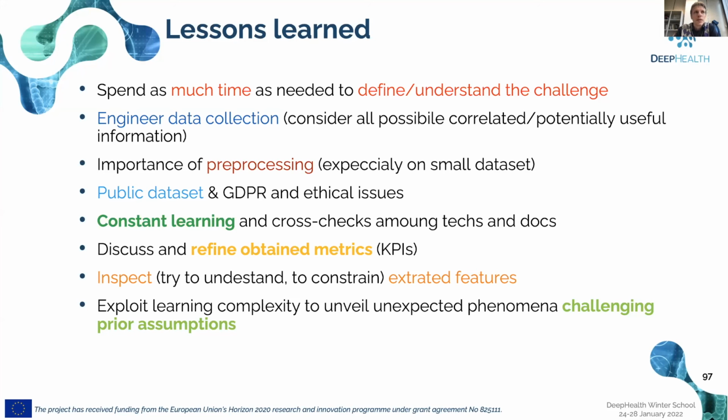So pre-processing is really an important thing. Also, in the radiologic example, you have seen that you have to convert the radiologic unit to images to input in your pipeline. This may be a trivial thing, but again, to be handled with care.